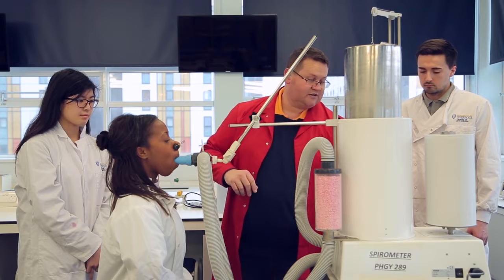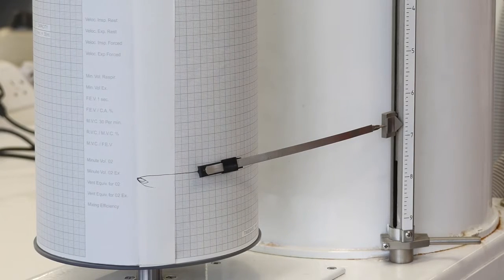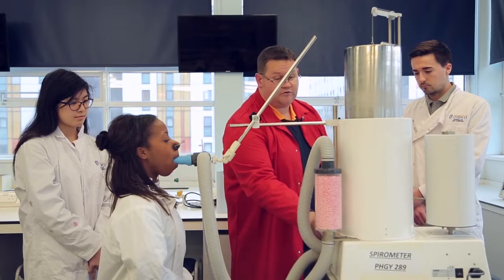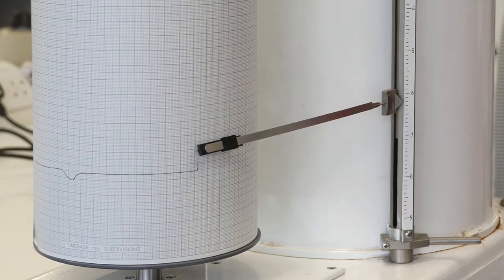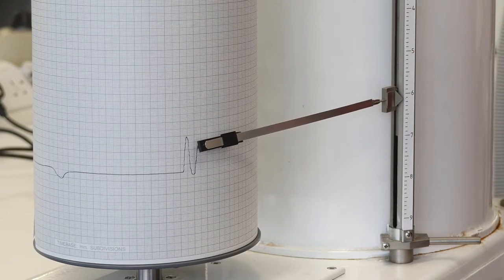So I will set the kymograph going. It's rotating at two and a half millimetres a second, so it will allow us to do some analyses later if we so wish. What I will do is move the valve over to the spirometer, and if everything's working, that should be moving up and down.